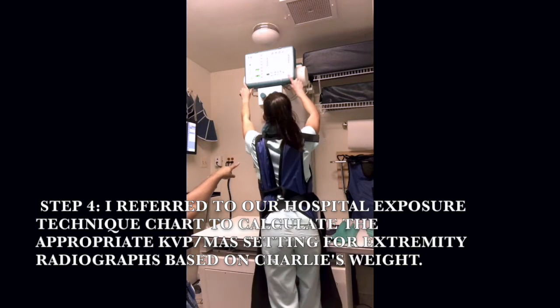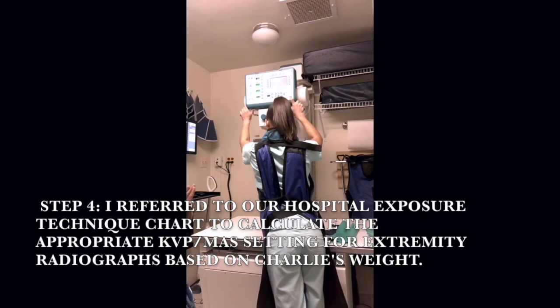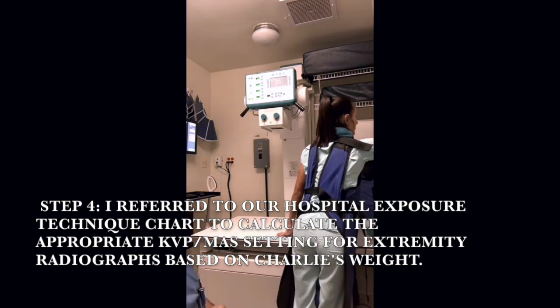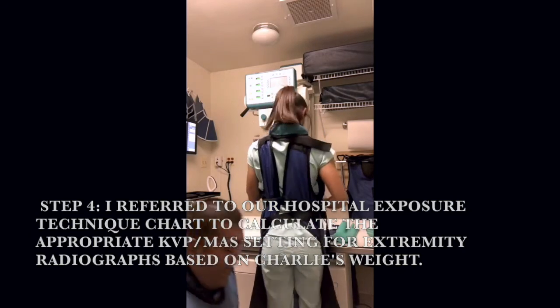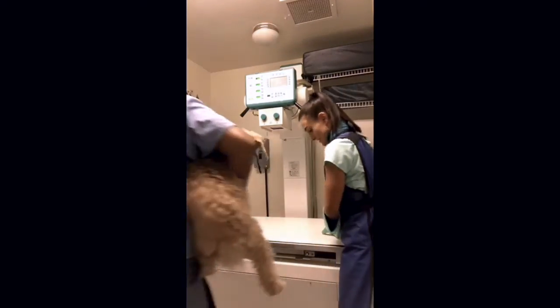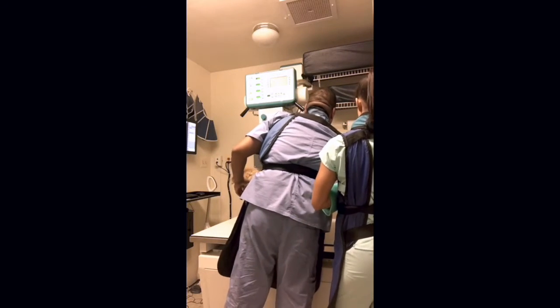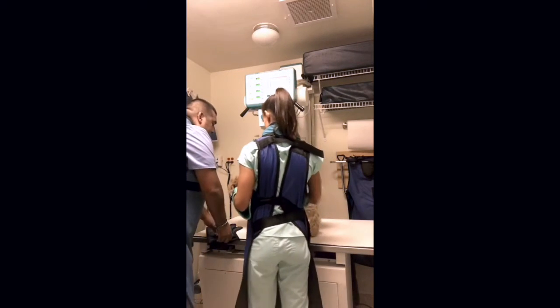At Ballston Animal Hospital, we actually do not measure the patient's extremities. We have a hospital exposure technique chart that we refer to based on the patient's weight and the body part that you are going to be X-raying. It saves us a lot of time, and it's really convenient because we don't have to get the patient all worked up trying to measure the body part in which we are going to take radiographs on. We just look at the patient's most current weight, and it'll give you the mAs and kVp.